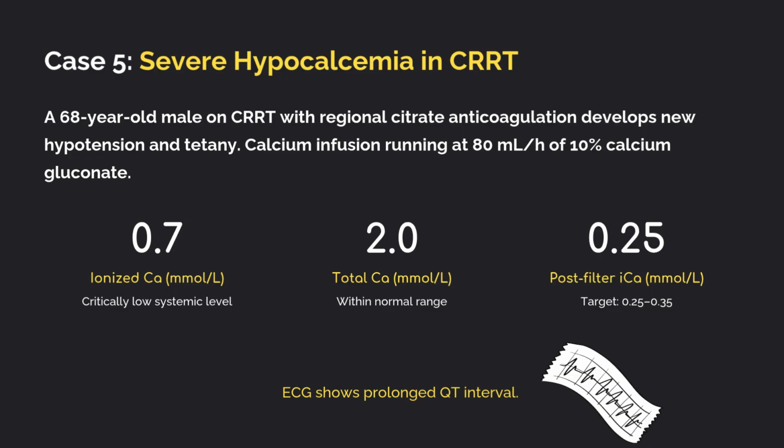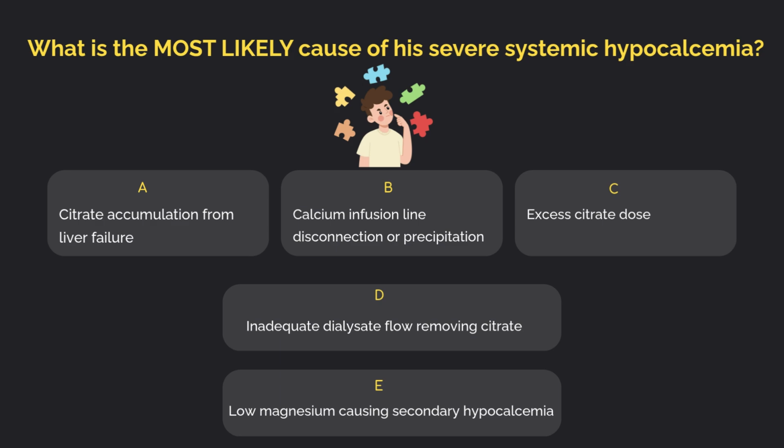So the key here is normal post-filter calcium, but critically low systemic calcium. This will guide us towards the right diagnosis in the next slide. Now, the question is, what's the most likely cause of his severe systemic hypocalcemia? Let's look at the options carefully.